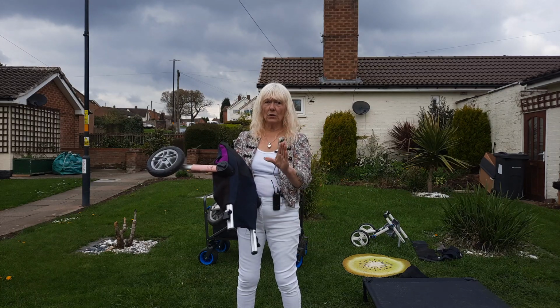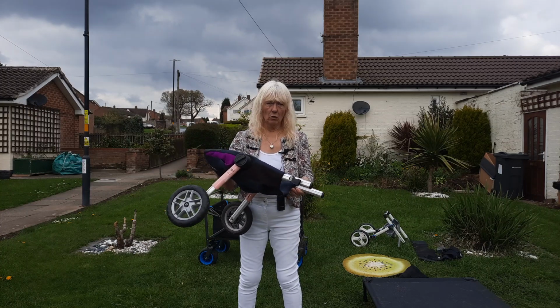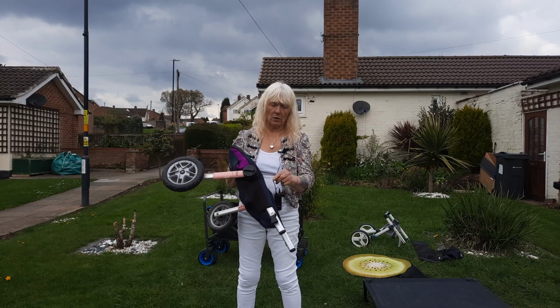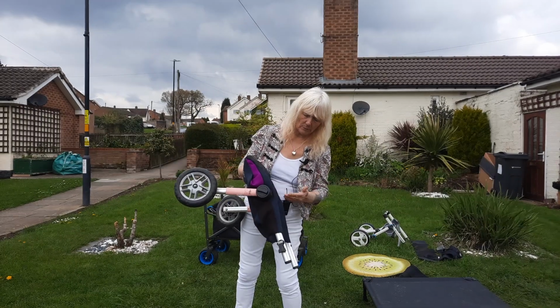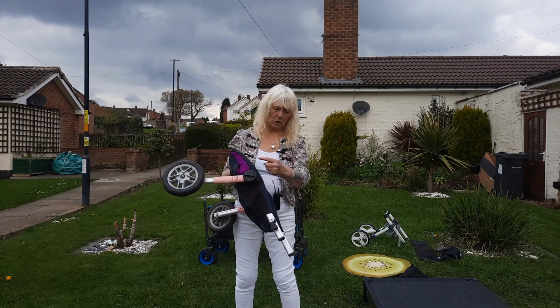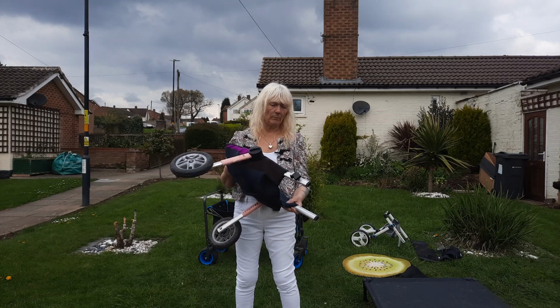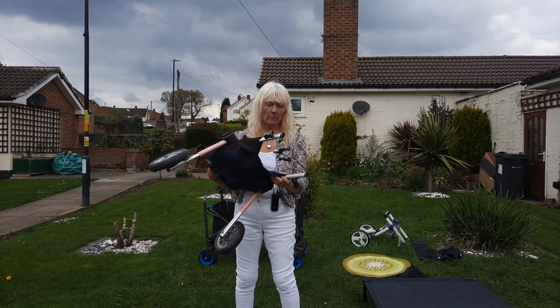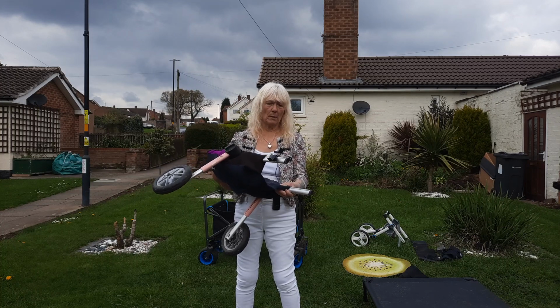But you know, it does the job. Since we put that on, she has never and cannot come out of there. You could also add, which I think we're going to as well, because when she's going along and she wants to have a sniff at the grass, she comes up and her bum comes up to there. We're going to add a couple of straps crisscross across here, only lightweight, just to make sure that that doesn't happen. But she cannot come out of this. So there's an idea for you. Always having little ideas how to make little improvements to your own equipment.